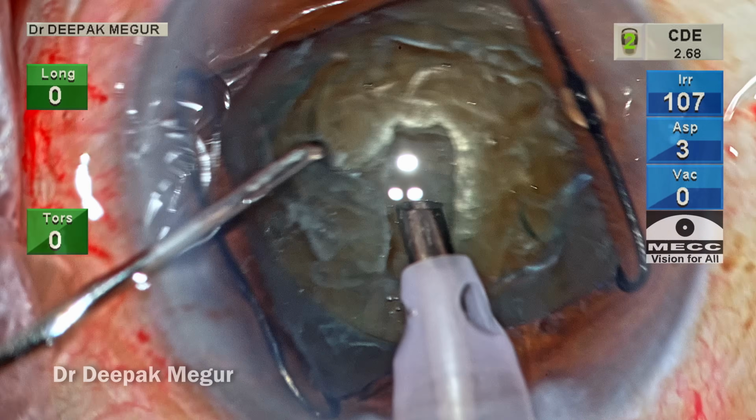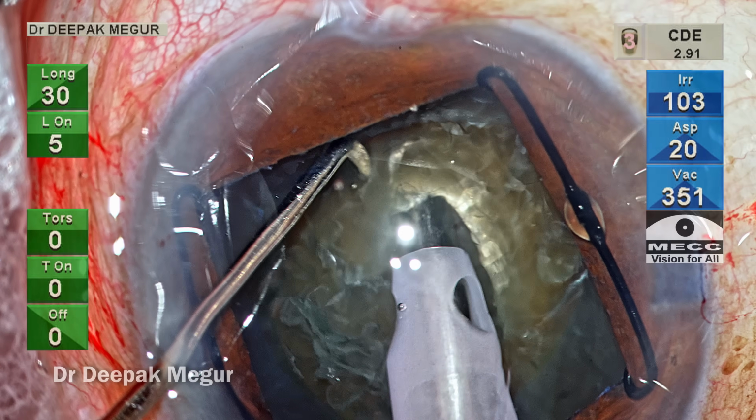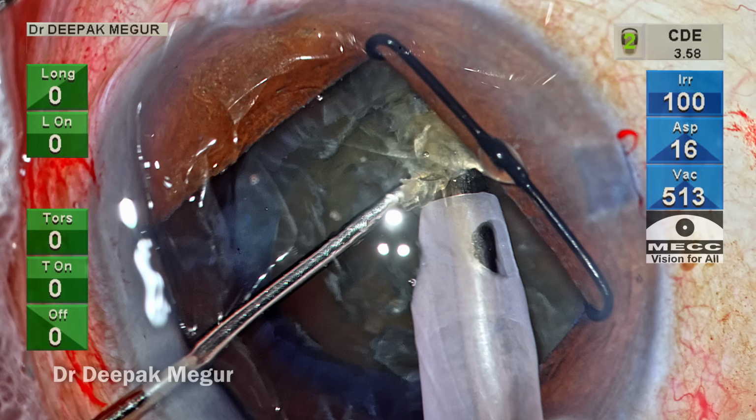Now is the time to do the chopping. The tip is buried into the substance of the nucleus. I'm using just the longitudinal energy. Hold the nucleus. The vertical chopper goes down, and then there's a lateral separation maneuver.